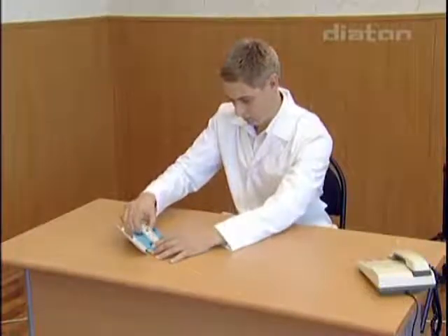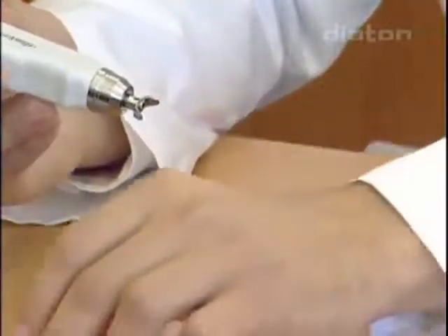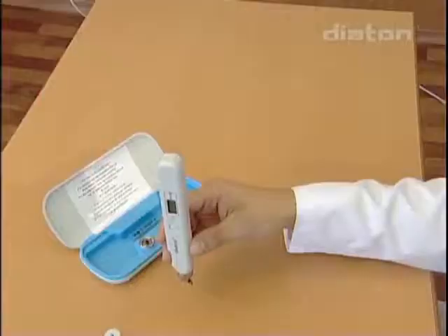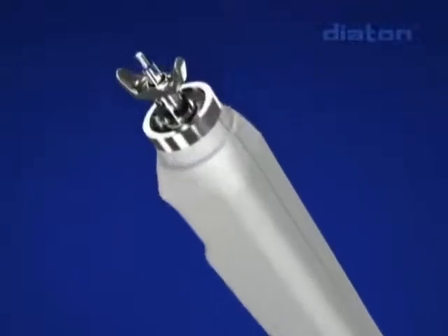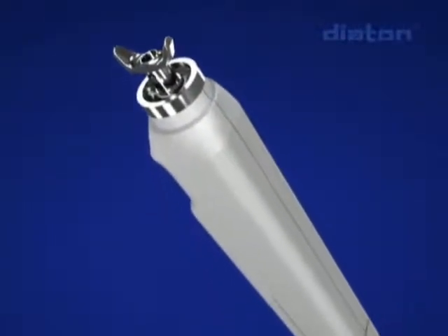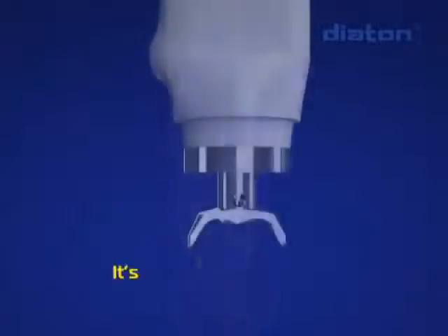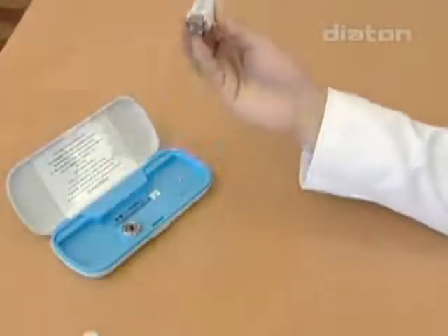Before each measurement, you should get the tonometer into the functioning position. Take the tonometer in hand with its tip pointing downwards, with the rod visible in the tip area. Turn the tonometer upwards fluently — the rod will go inside and fix inside the tonometer. Return the tonometer fluently, without quick movements, to the position with its tip downwards. The rod must be fixed inside the tonometer; this is the initial position for the rod to start measuring.